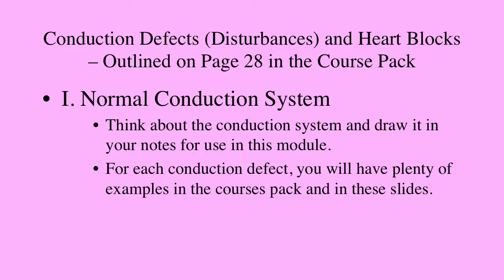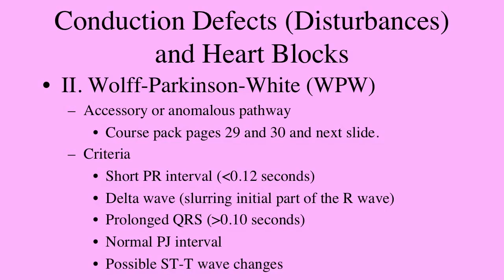We'll be looking at problems that are occurring in the conduction pathway and the conduction system. And you'll have plenty of examples through the course pack and in the PowerPoint material. And we want to look through these examples and have you diagnose the EKGs and also know the criteria for each of these.